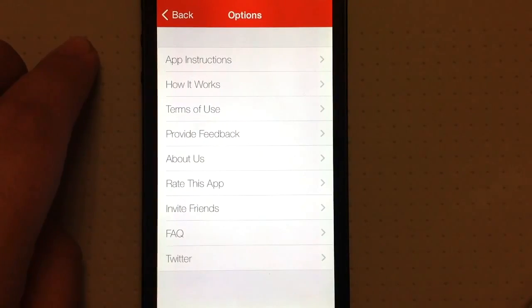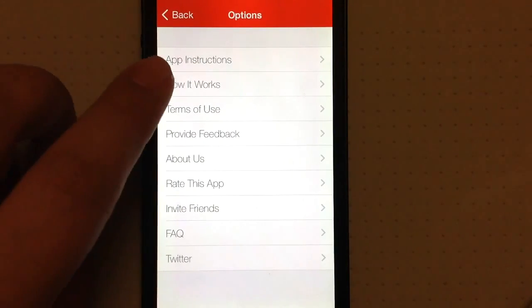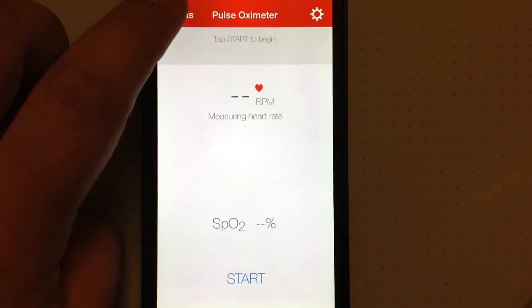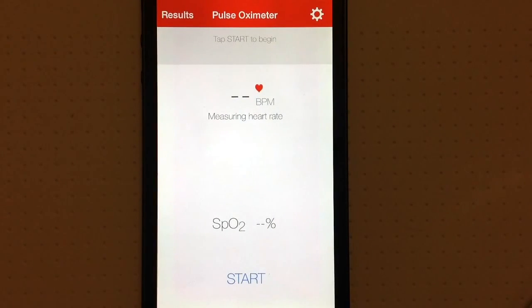There's also an options menu where you can see instructions, how it works, terms of use, and more. Again, Pulse Oximeter is available to download from the App Store for $3.99 and is designed for iPhone. This has been Sarah Hanlon with iPhoneAppReview.com taking a look at Pulse Oximeter — till next time!